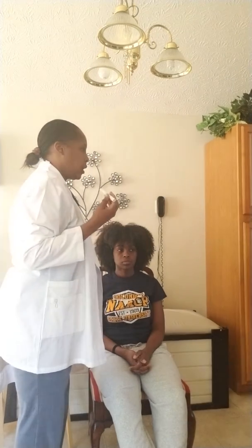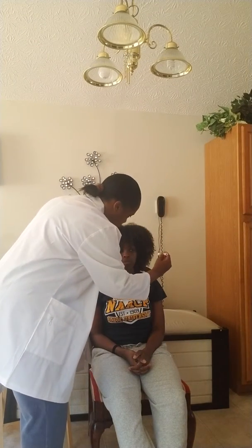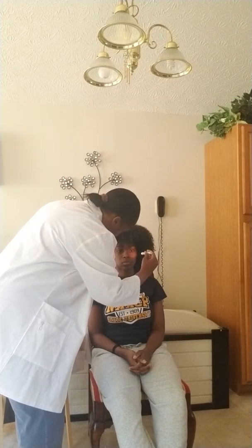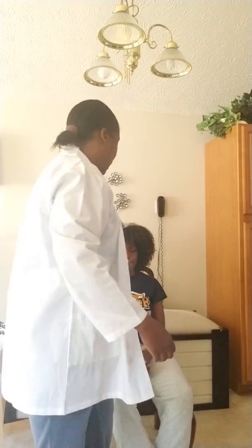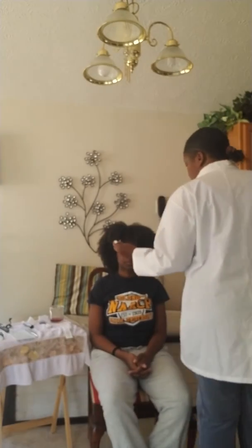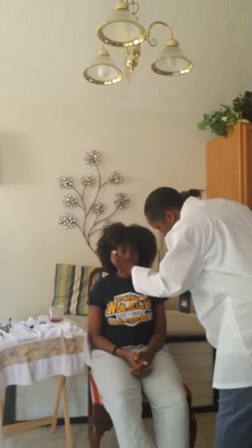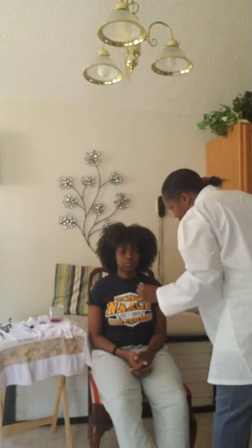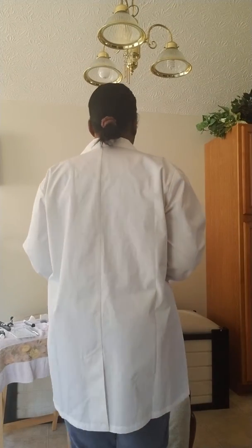Now I'm going to do this consensual by bringing the light in. I'm going to watch this left eye constrict, and at the same time the right eye should be constricting, and it does. And I'm going to do this on the opposite eye to make sure, and at the same time it should constrict, and it does.